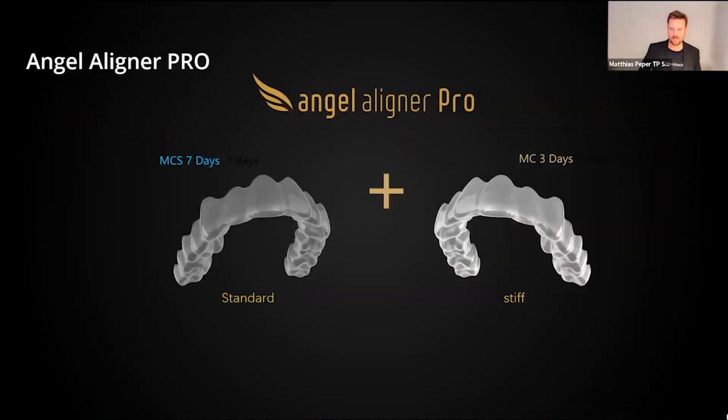Angel Aligner Pro. As we all know, we have also seen it at the beginning that we have different velocity protocols. And for Angel Aligner Pro, we have a little bit more movement for one aligner, but we need to understand that we have 2 aligners for each step.